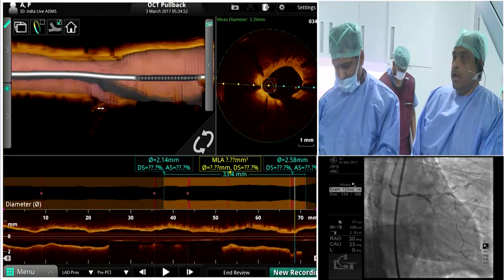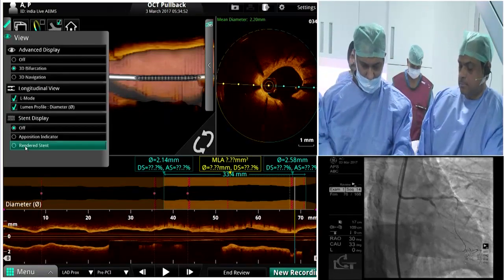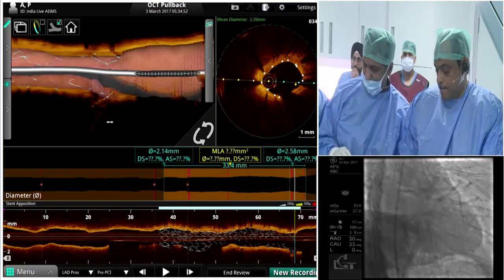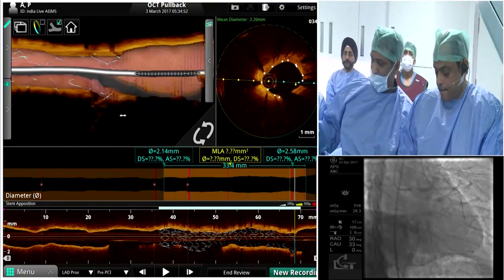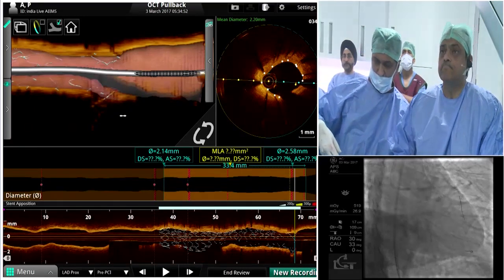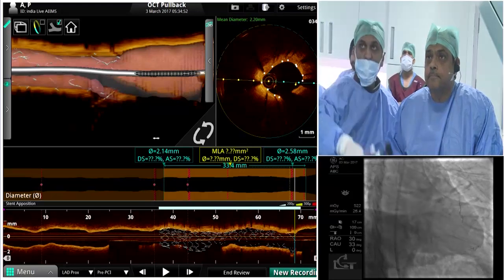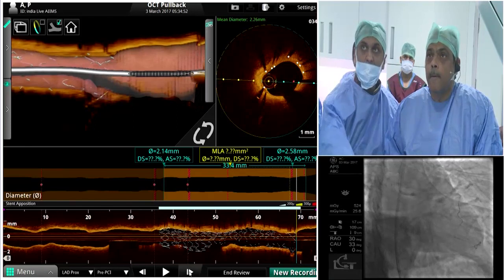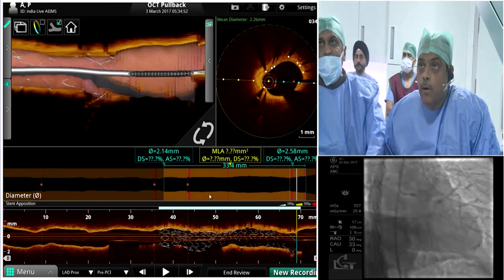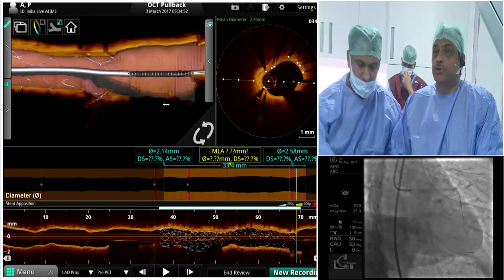It's very difficult to say. If we are not able to dilate, what is the panel's option? Should we use the cutting balloon? Garan, what's your choice if he could not flare, could not dilate the strut? I'm very afraid of using a cutting balloon through the struts into the side branch. I witnessed one occasion where, after crossing with a cutting balloon, the operator was not able to pull it back. So maybe some other non-compliant balloon or another cell, if it is possible. Crossing with cutting, I think it's potentially risky. What about a rotablator? This is the last resort. Rota is not a choice, I think.